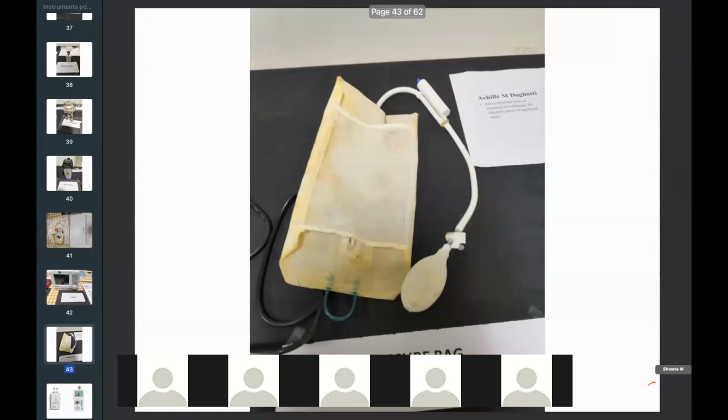Somebody was going to speak on this pressure bag, but you all know that this pressure bag is basically used if you want to give fast infusions for any patient. It is also used for monitoring the arterial and the central venous pressure lines, where you put normal saline with heparin on a high bag system at at least 300 millimeters of mercury. So a high pressure is created.